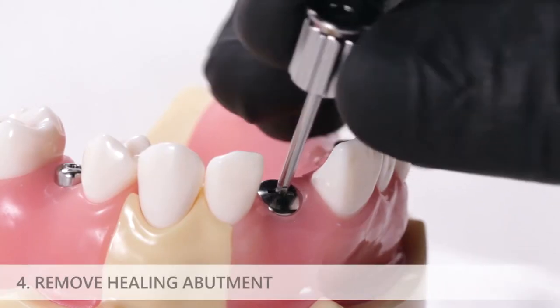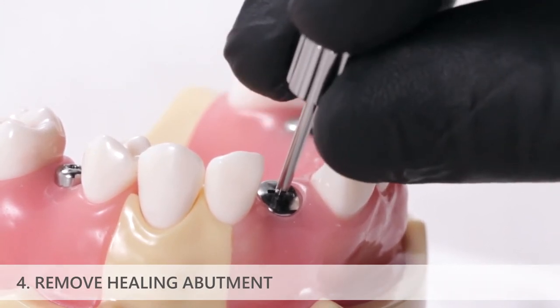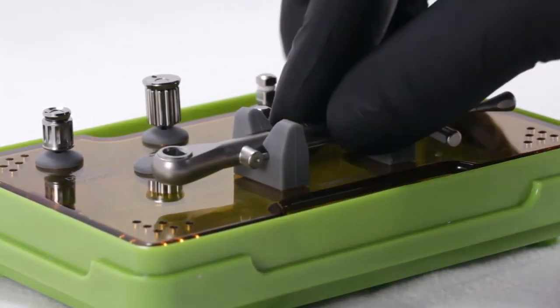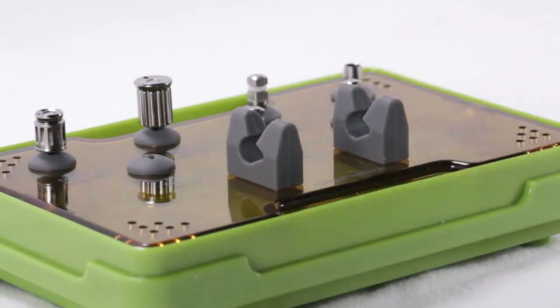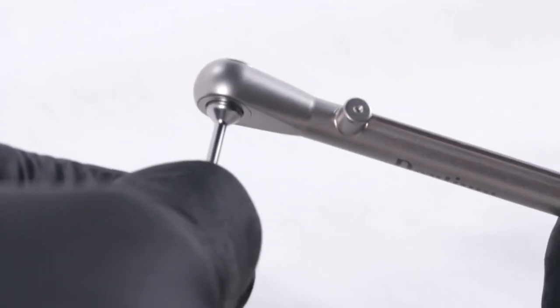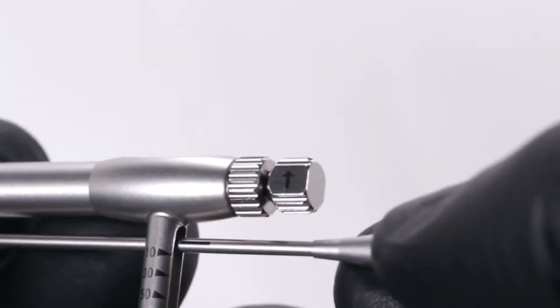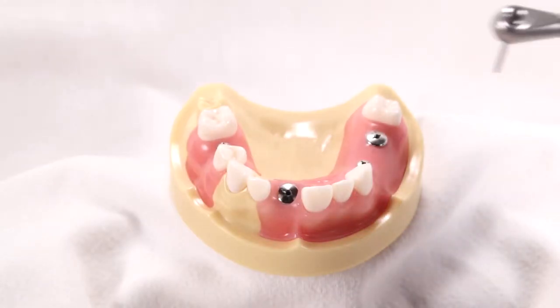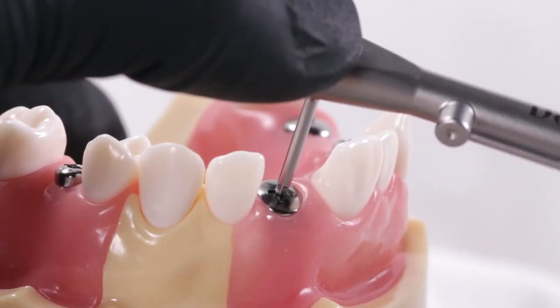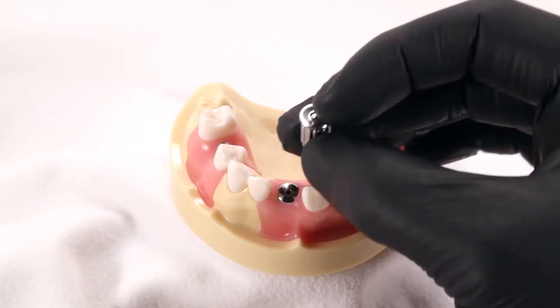Insert the prosthetic driver into the healing abutment and twist counterclockwise to unscrew it. In some situations it may be too difficult to unscrew the healing abutment by hand. In this case, select the torque wrench and matching driver from the prosthetic kit and assemble them. Be sure to orient the direction indicator arrow facing away from the torque wrench handle. Insert the driver onto the healing abutment using one hand to stabilize the head of the torque wrench. Unscrew the healing abutment until you feel it begin to rotate, then unscrew the rest of the way with the prosthetic driver.